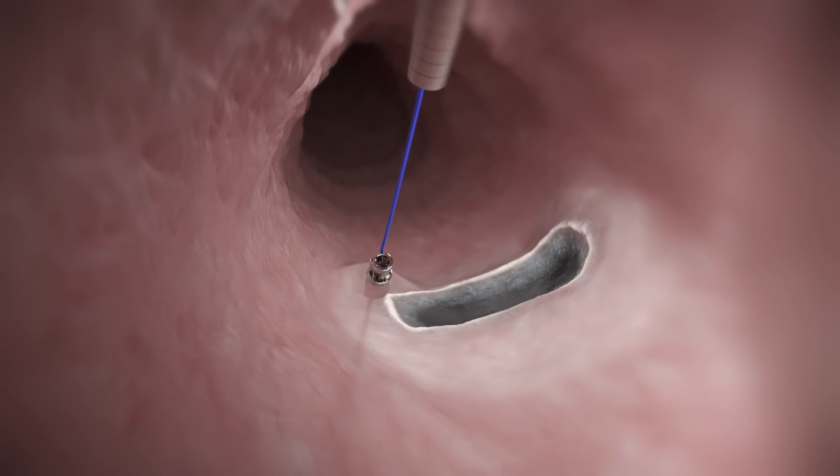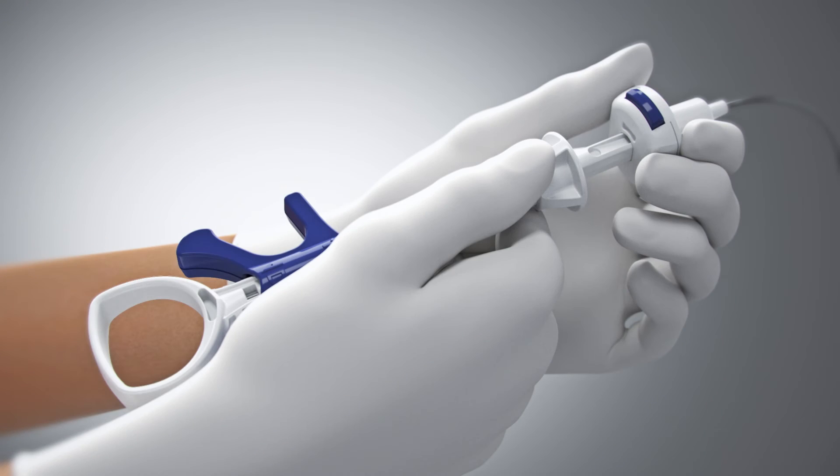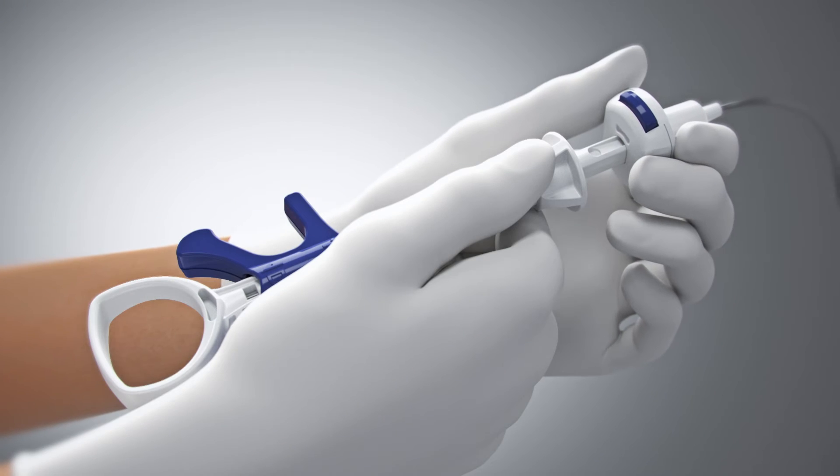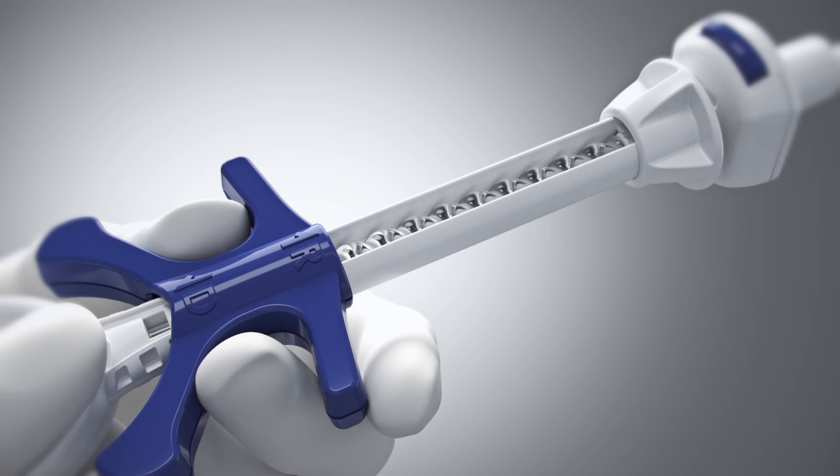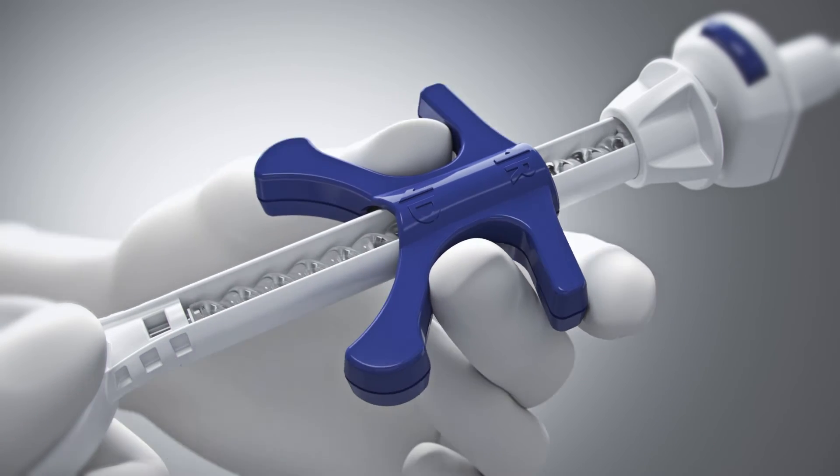Remove the device catheter from the scope. Reset the handle by sliding the push catheter back to the locked position until it clicks into place. Move the handle slider to the R position.